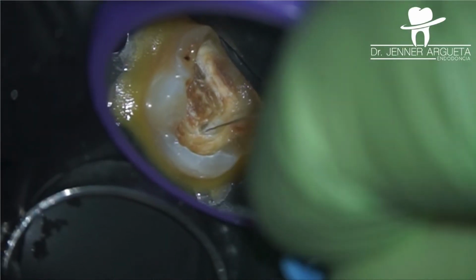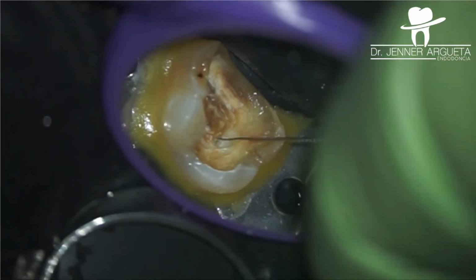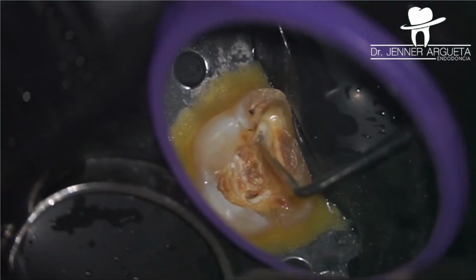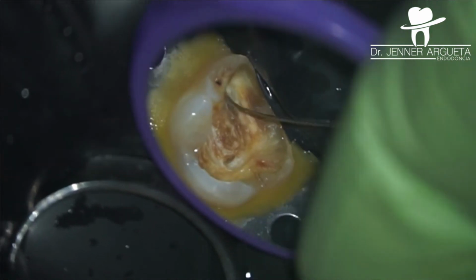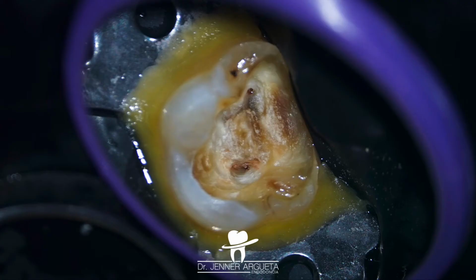In this video, you can see that we were able to locate first the entrance to the palatal canal, and then we were able to locate the mesiobuccal canal.